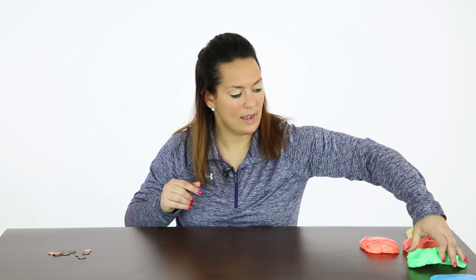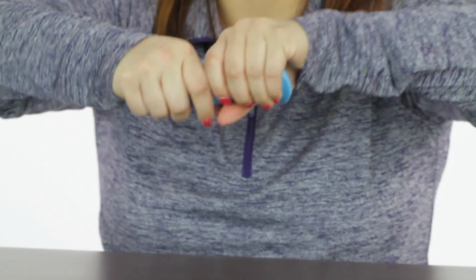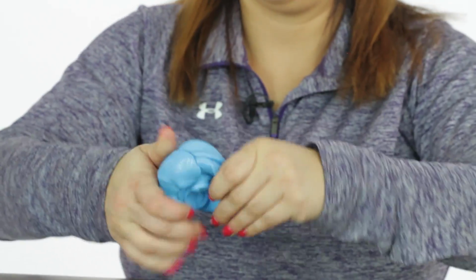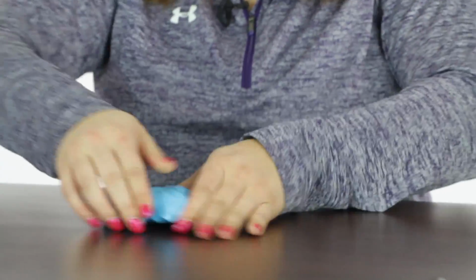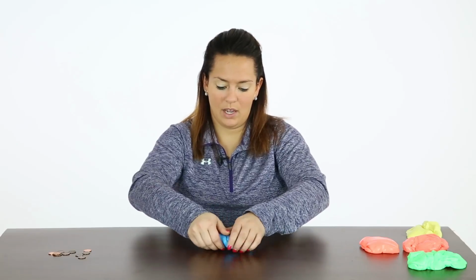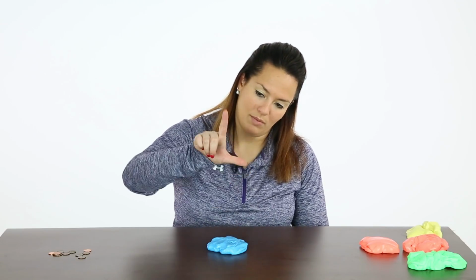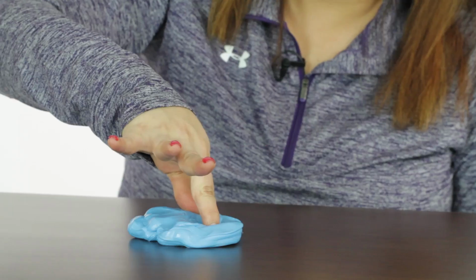All right, and the last we have is blue, which is hard. It requires quite a bit of strength to pull and manipulate. Some more exercises that you can do for finger and hand strength by making it flat. So before we pinch to make mountains, and now we're going to use the thumb and each finger to push out. So we're going to push it out.